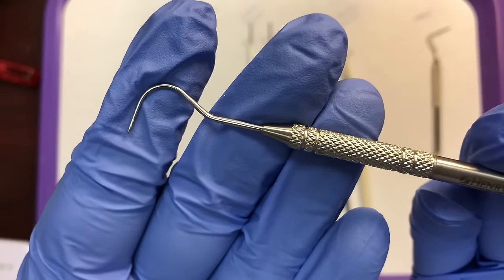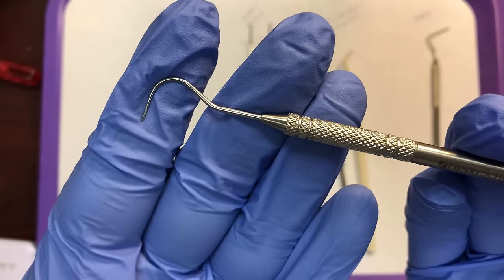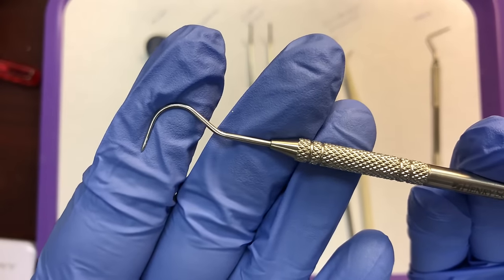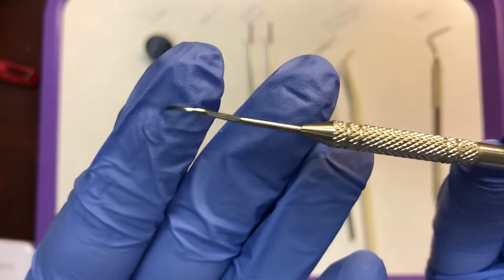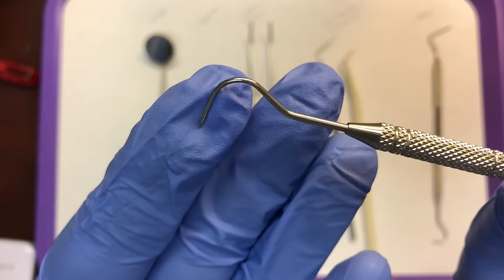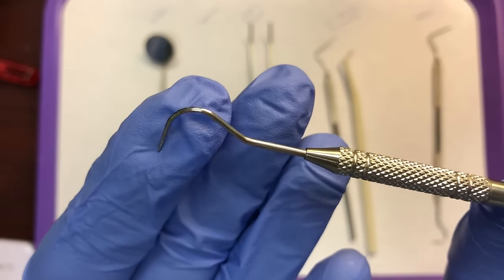The next instrument is the Explorer, which has a sharp point on it. The purpose of the Explorer is to examine the teeth for any irregularities. The doctor and hygienist use the Explorer to look for cracks, cavities, or any other irregularity on the surface — maybe an overhang on a filling, cement that wasn't cleaned up after a crown, or excess bonding. These work by tactile sensation; you run the instrument across the surface and feel the point catch on any irregular surfaces, divots, cracks, or raised areas.